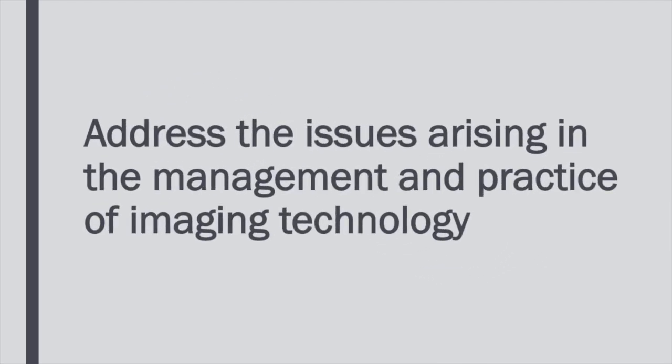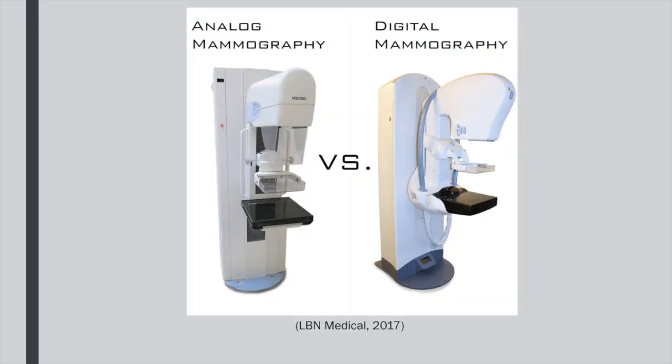Address the issues arising in the management and practice of imaging technology. Mammography is the best tool for screening and diagnosing breast cancer, but this imaging technology also has issues with management and practice. Many radiology practices are converting from film mammography to digital mammography. The first clinical digital mammography system was approved in 2000, but the adoption of this technology has not been thriving steadily due to high costs and a lack of data supporting improved diagnostic performance.